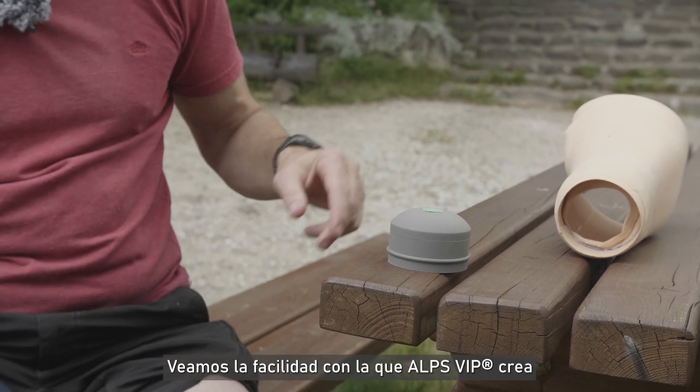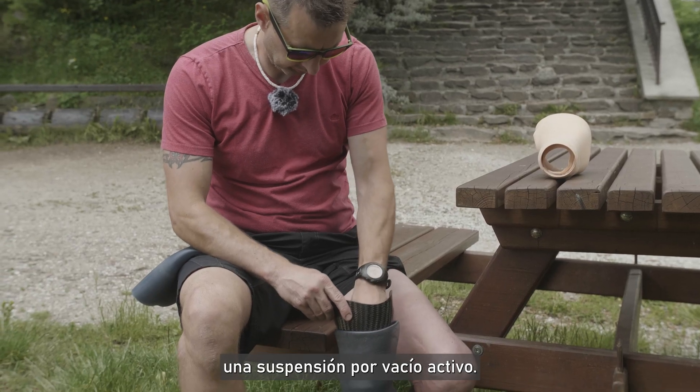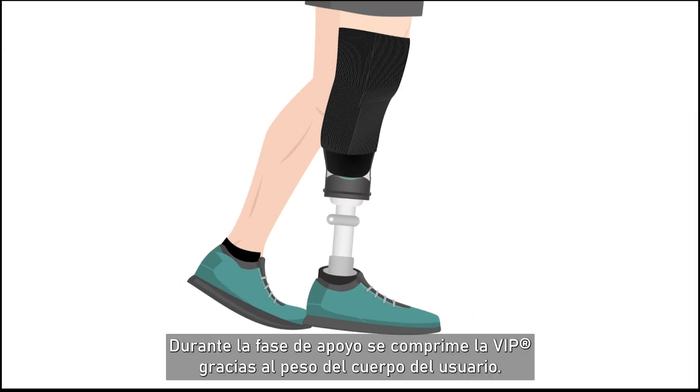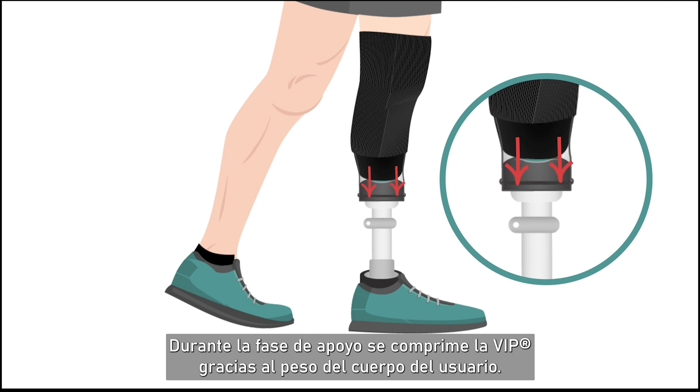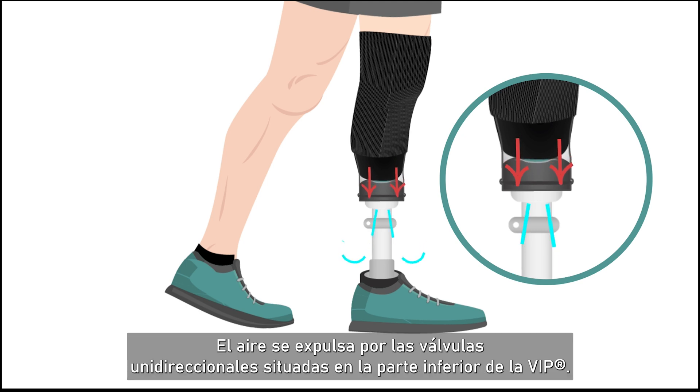Let's see how easily ALPS VIP creates an elevated vacuum suspension. During the stance phase, the VIP is compressed by the weight of the patient's body. The air is expelled from the one-way valve located at the bottom of the VIP.